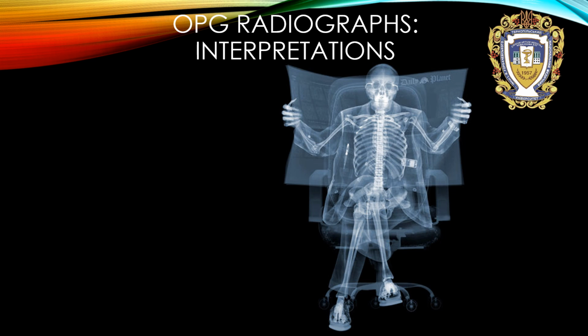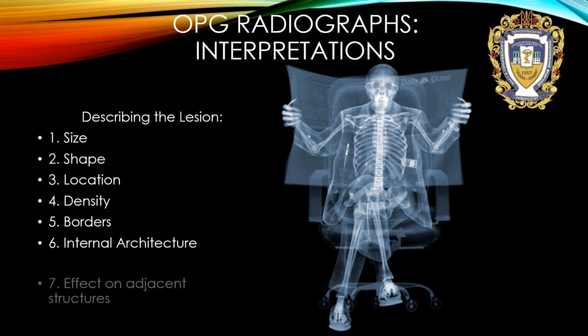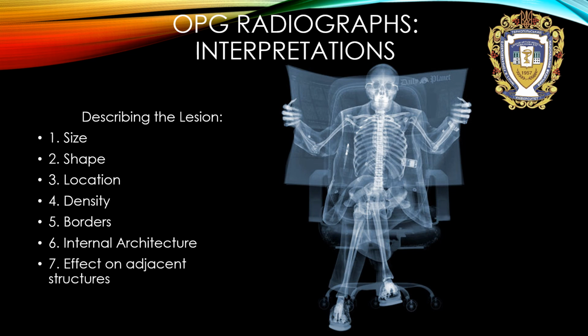Interpretations of OPG. Describing the lesion. Every lesion must be described with size, shape, location, density, borders, internal architecture, effect on adjacent structure.